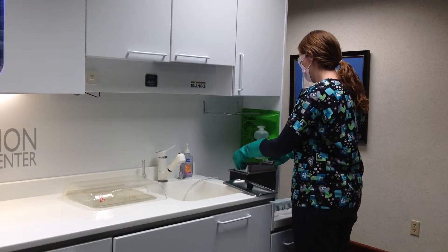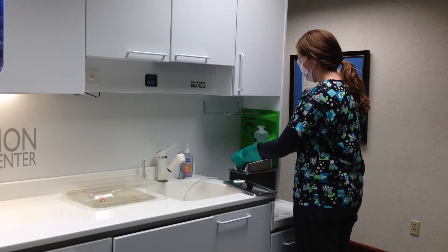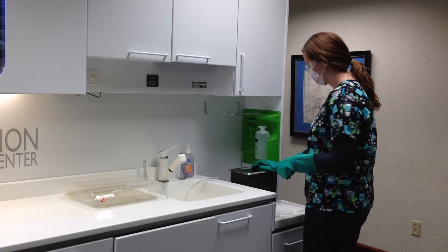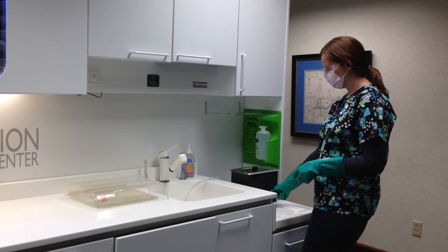The timer is then turned on and set for 5 to 15 minutes depending upon the time needed to have the instruments be visibly clean. The solution it's in is specifically formulated for use in the ultrasonic. Some solutions will have an enzyme or antimicrobial activity.